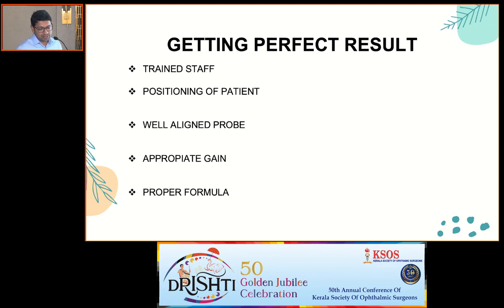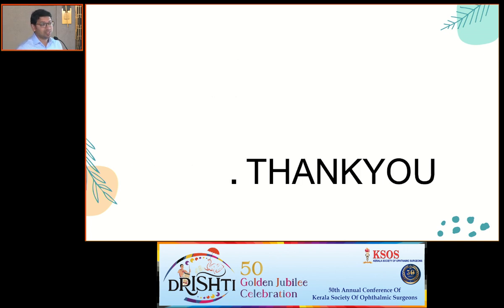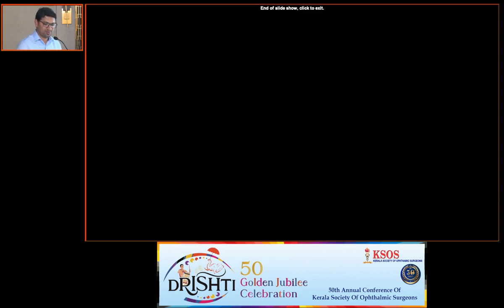In a nutshell, you should have trained staff doing biometry in all patients, proper positioning of the patient, a well-aligned probe, appropriate gain, and a proper formula to give the best results. Thank you.